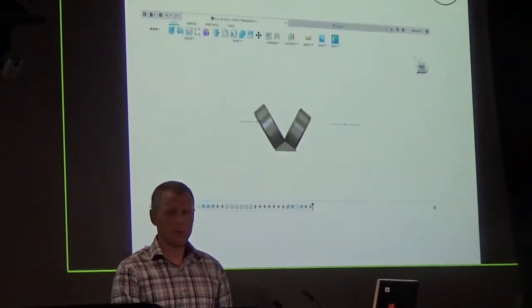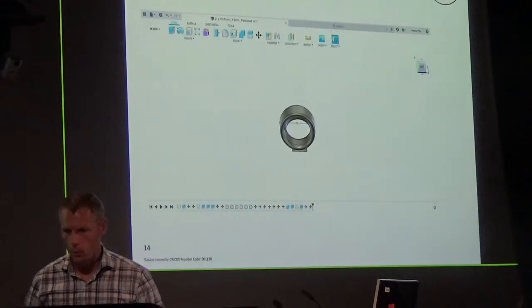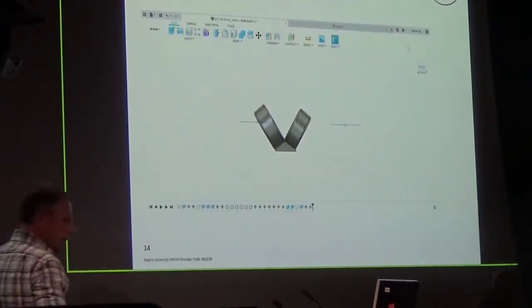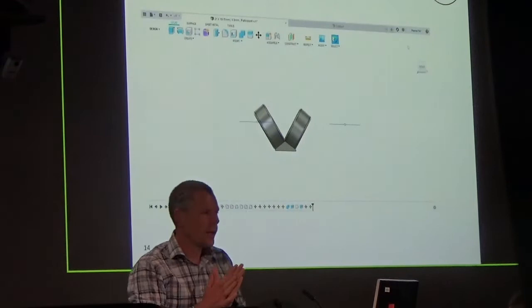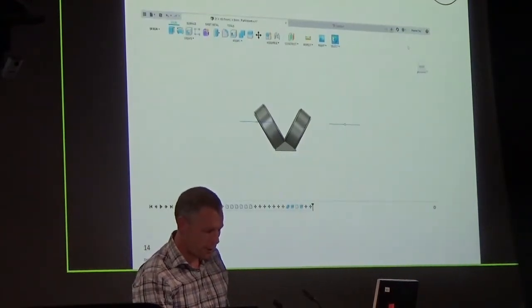And again, we've got this figure of 8 splint. So I'm just going to sneak back to my bag, because I've got a couple in there. I'll just pass around while I'm talking. So there's the thermoplastic figure of 8 splint that I've moulded, and also 2 figure of 8 printed splints that you'll see as they come around. So you'll see the end product of that.